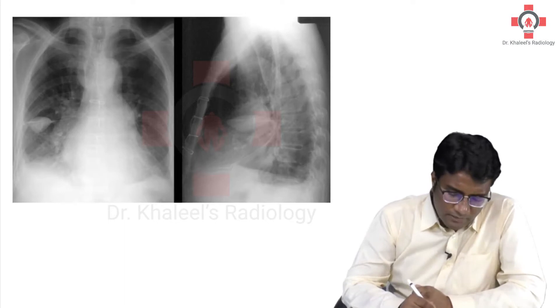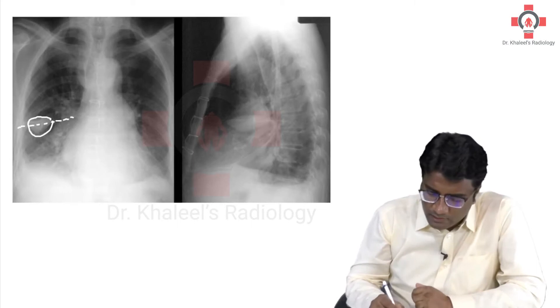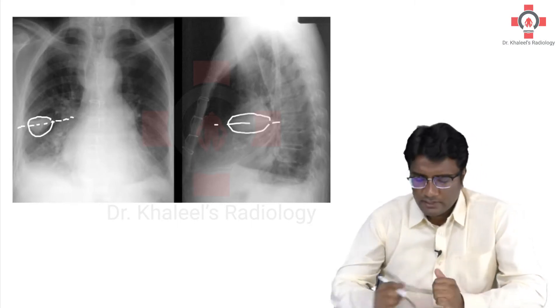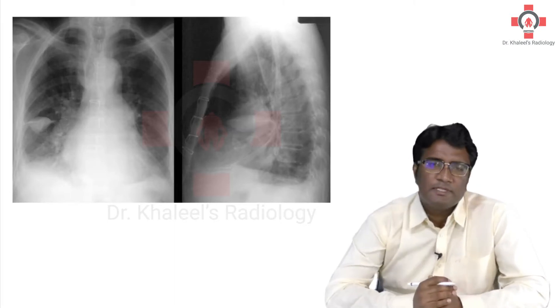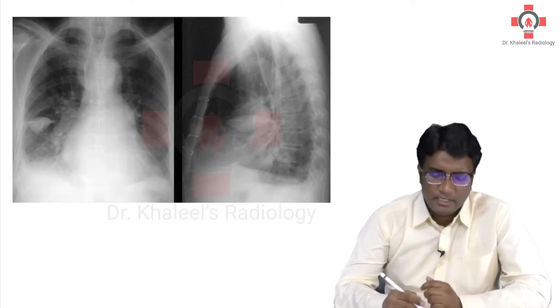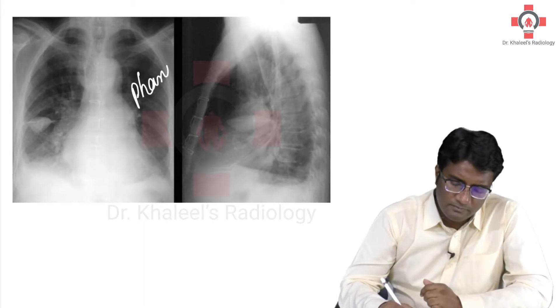If you see more carefully, it is noted just at the fissural lines, and on the lateral view also you can see this — it is seen in the fissural areas. So, this is basically an interlobar effusion, a phantom tumour — interlobar effusion or a phantom tumour.